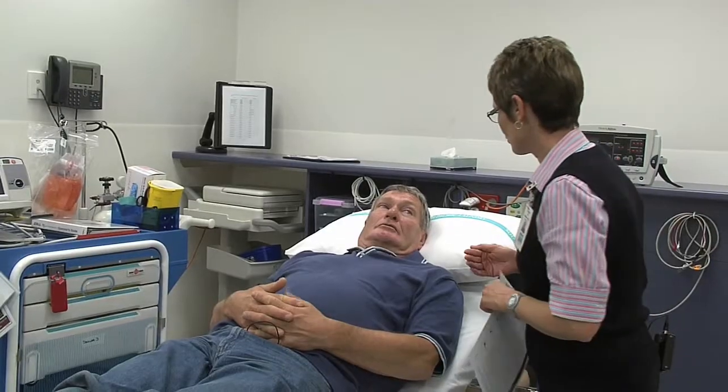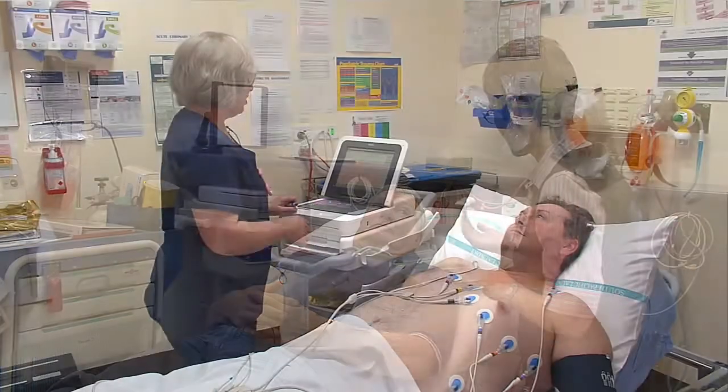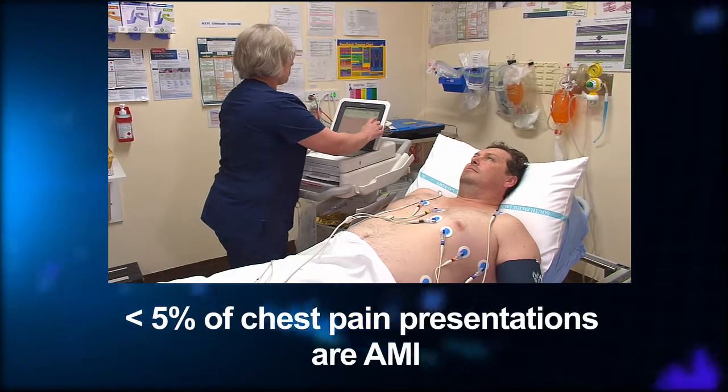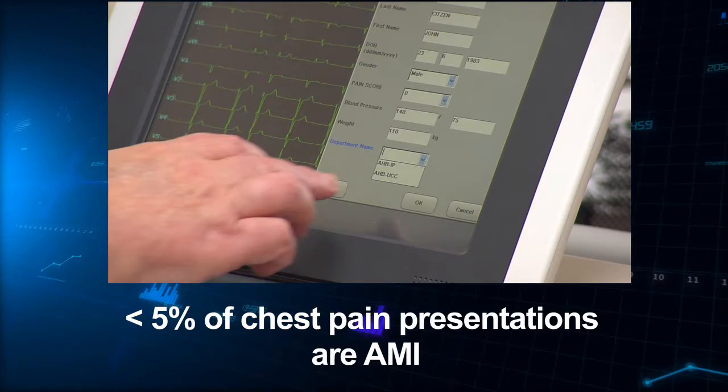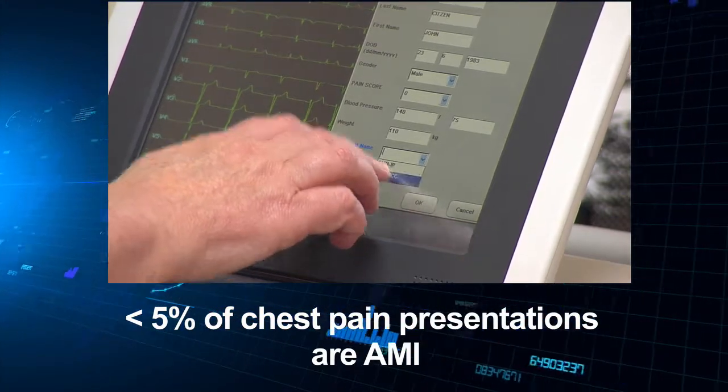You'll commonly get phone calls from GPs asking for advice about what to do about this person with chest pain, what to do about this ECG, or my God, do I need to thrombolyse this patient who looks like they're having a STEMI? Using this system is a way of supporting both them and yourself so you can see what's going on.